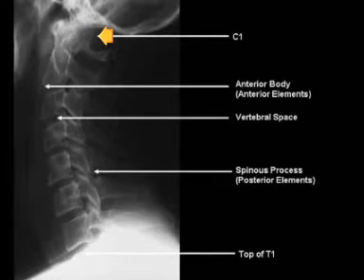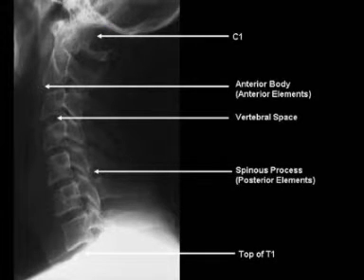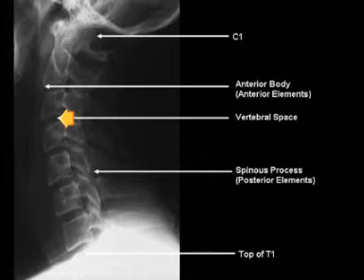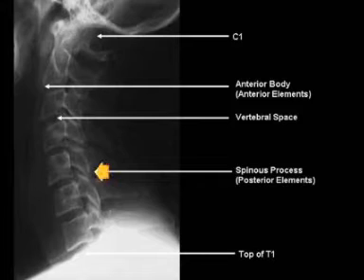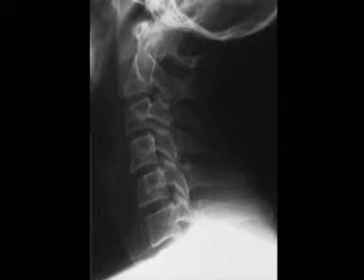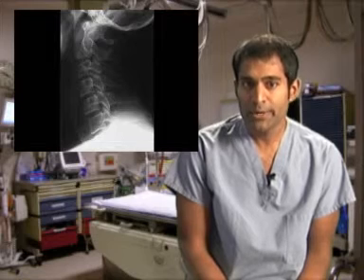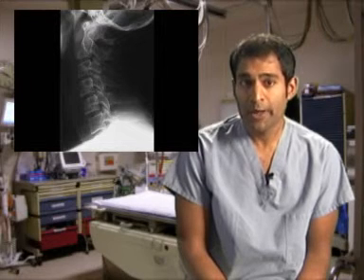In this normal cervical spine series, notice C1 and the top of T1 is visible. With that, one can see the three columns: the anterior elements in the anterior body, the vertebral space, the middle elements, and finally the spinous processes comprising the posterior elements. In this example, you do not see the top of T1, therefore this would not be considered an adequate lateral C-spine.